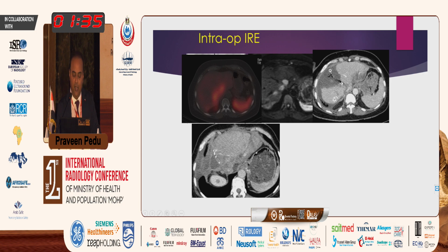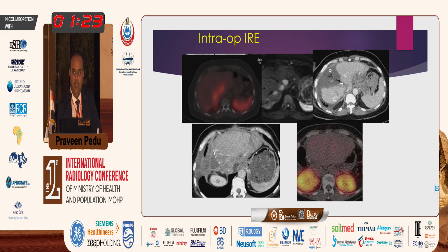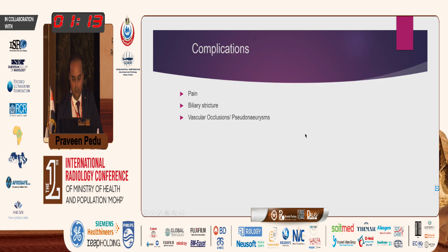So, the patient went on to have an uneventful stage 2 liver resection, where we removed the remaining right lobe, and you can see the outflow, the left hepatic vein, is preserved. So this is the follow-up PET scan, which was performed 6 months after the procedure. You can see the remnant hypertrophied quite nicely, and there is no residual tumor. And more importantly, there is no damage to the venous outflow.